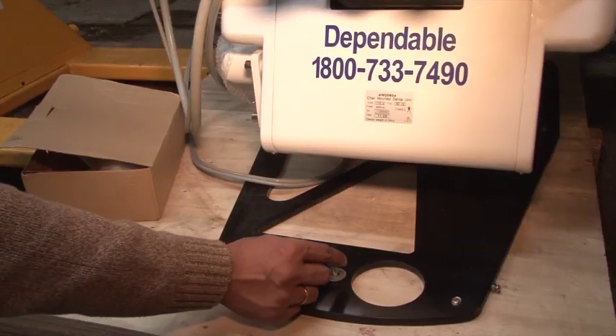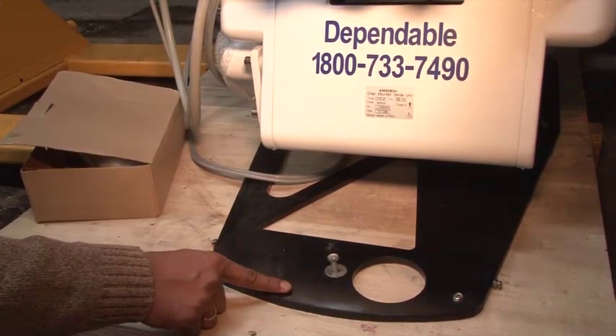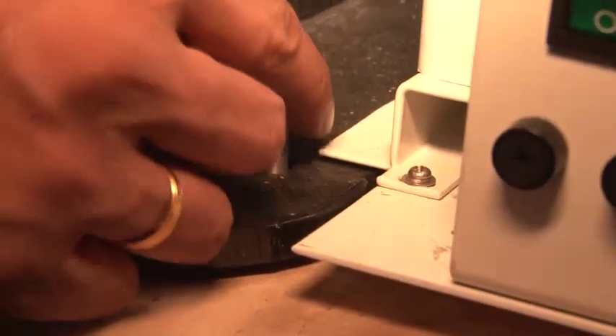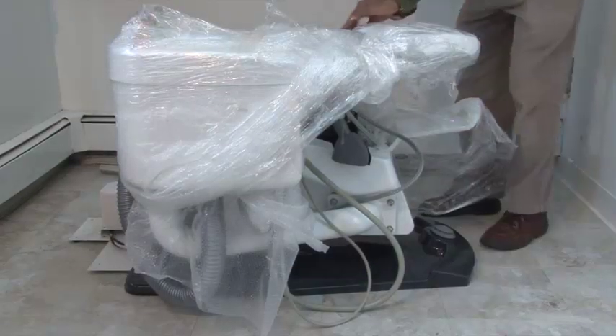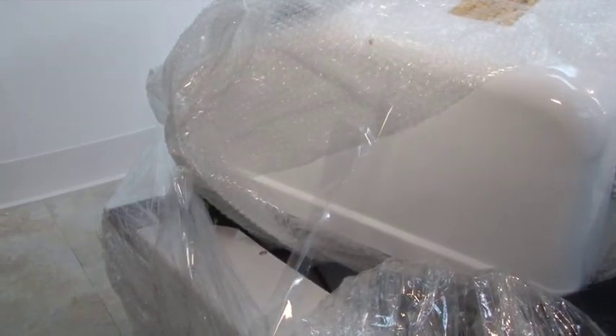Then unpack the big box that contains the chair and remove the safety screws from the front and back. When removing the packing material, be careful not to scratch any of the parts.